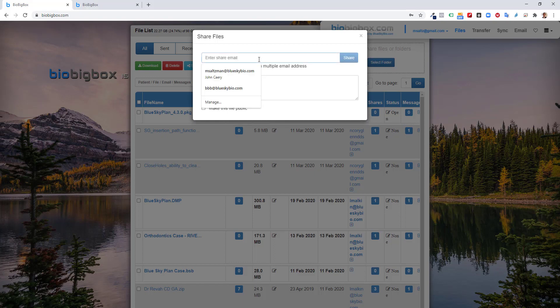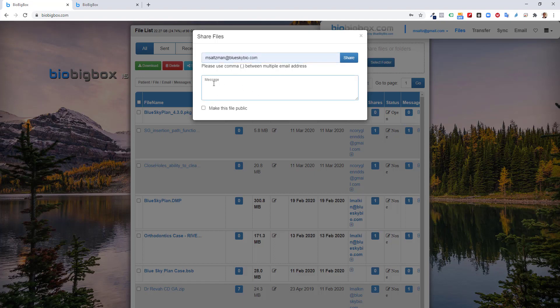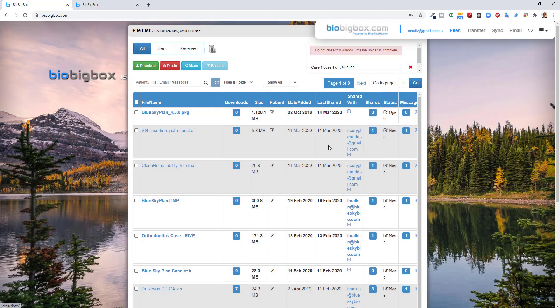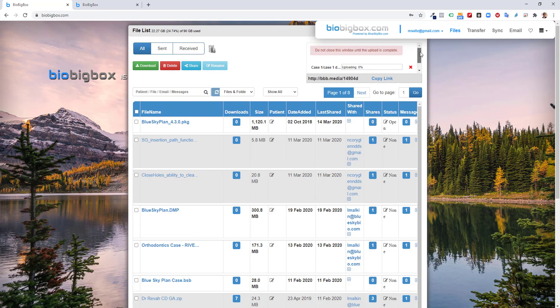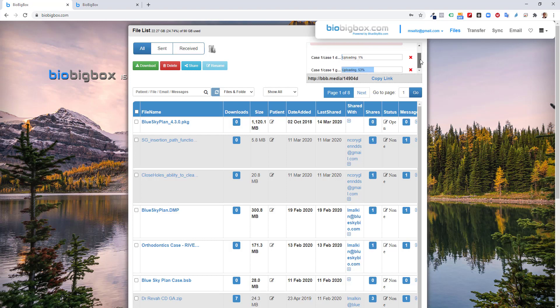And I'm going to enter the lab's email address. For now, I'll send it to msaltzman at blueskybio.com. That will be for demonstration purposes. And I could add in any other message or information I want to have sent with the files. Once I've done that, I click share. Now, we could see that bio big box is uploading the files. At this point of time, I'm essentially done. My share is complete. I could go on and work on other things like a treatment plan. You want to keep the window open until the upload is complete and you get a confirmation on screen that you've shared the files.